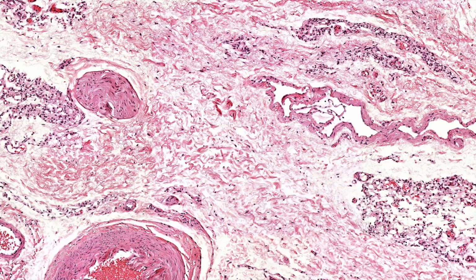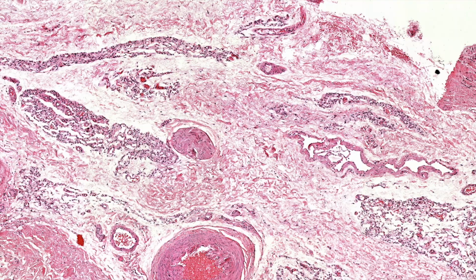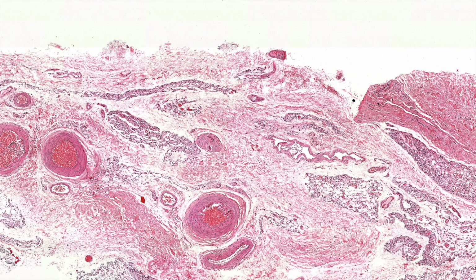It actually does look like a lymphatic there, but I thought for sure that I knew something was lymphatic or not before, and then stained it with D2-40. And I found that my ability to predict it reliably is not super high. So even though I'm a soft tissue pathologist with an interest in vessels, I can't always tell lymphatics from tiny veins. Okay, questions? Next case then.